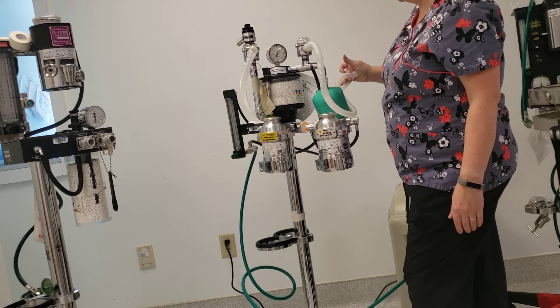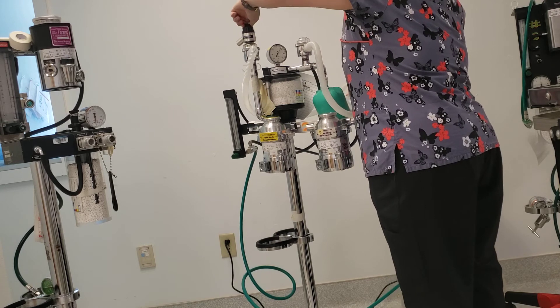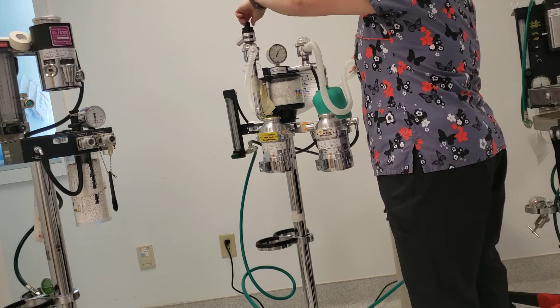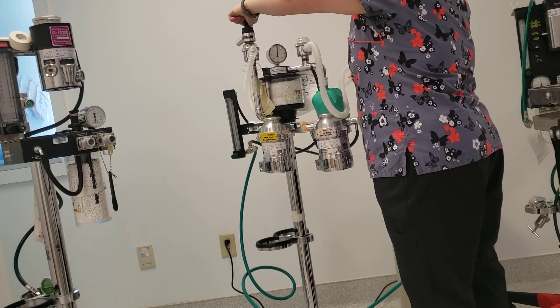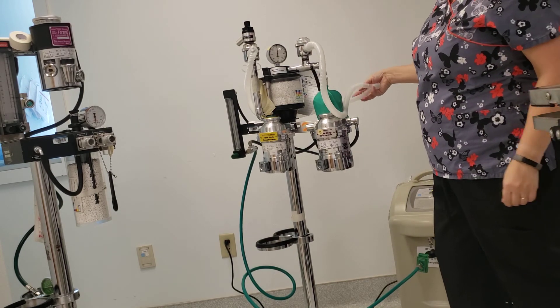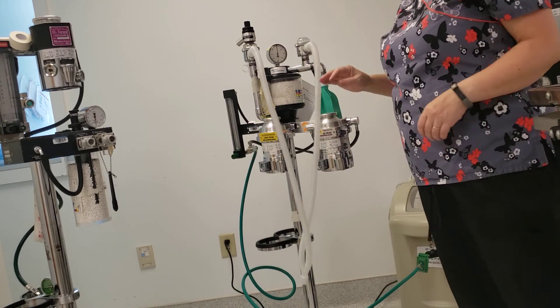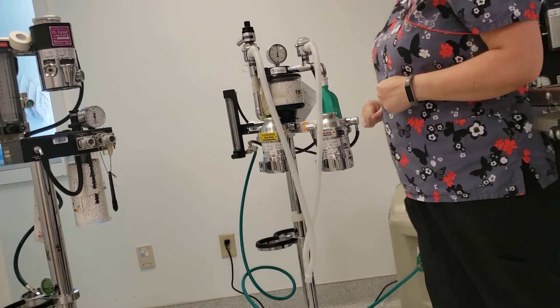When you're done leak checking your machine, you're going to open your pop-off valve. Don't get in the habit of releasing your patient end until after your pop-off valve has been opened. Now I can open this end, and there is no longer any pressure in my system. That is how you leak check your anesthetic machine.